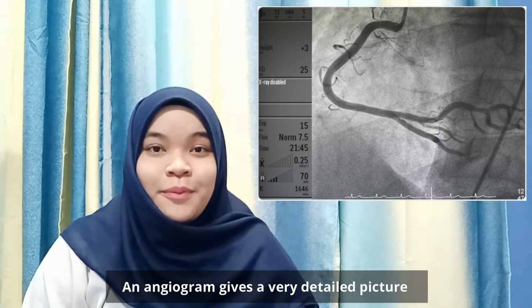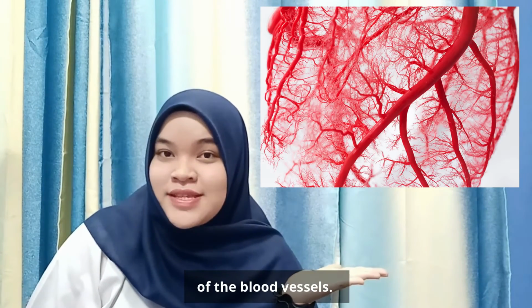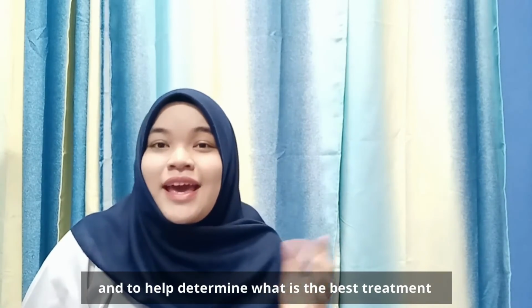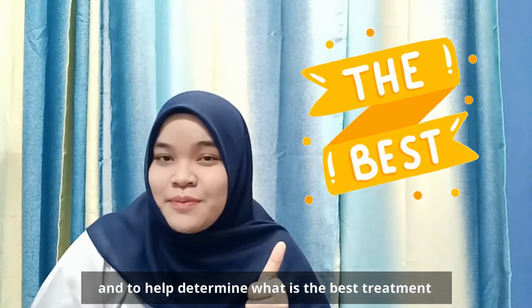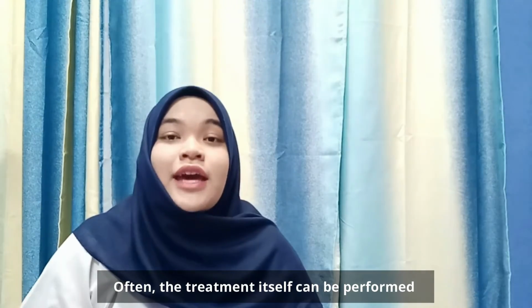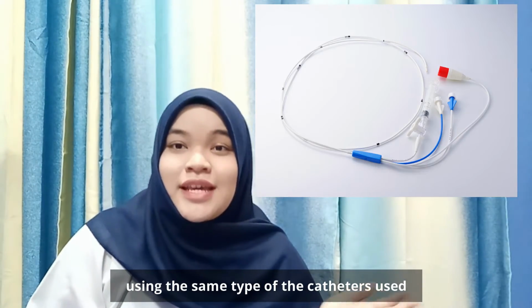An angiogram gives a very detailed picture of the blood vessels. Angiograms are used to make specific diagnoses and to help determine the best treatment in a particular case. Often, the treatment itself can be performed using the same type of catheter used in the angiogram.